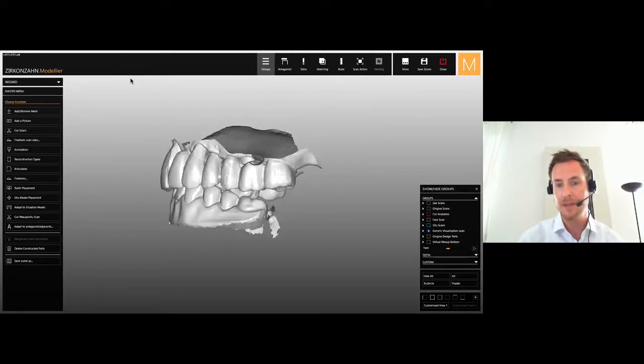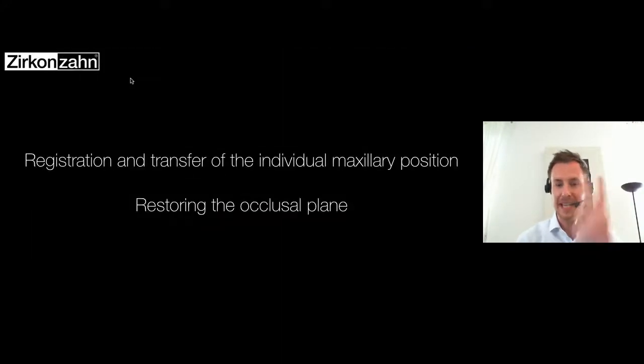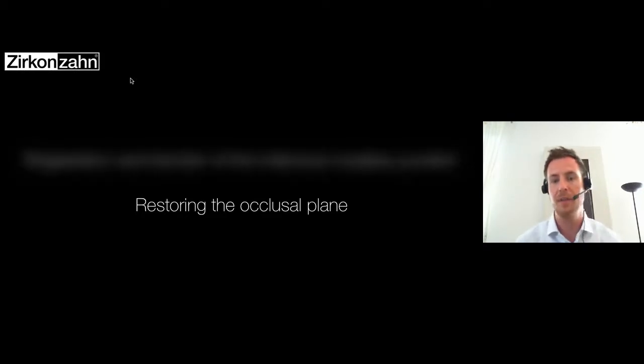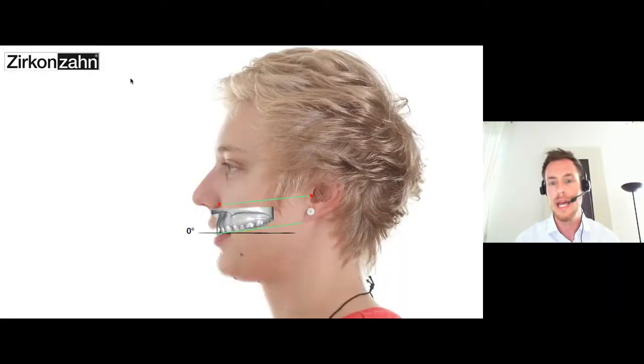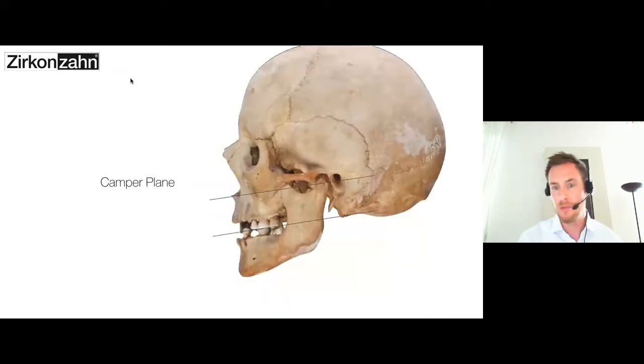And for that, I'm using the second function of the plane system to reproduce the occlusion plane. So by doing that, I have to measure something onto the patient's head. But slowly, we start with a part we know from the university or from the school.